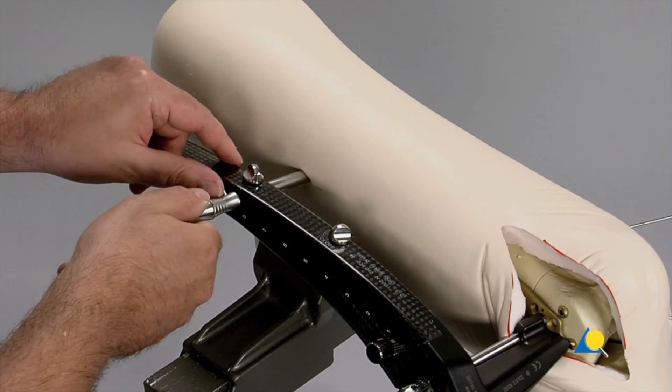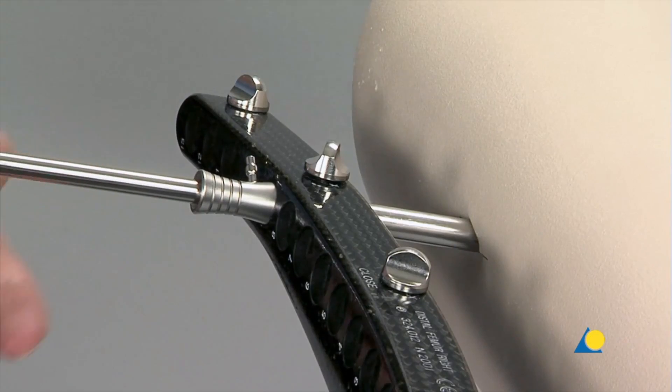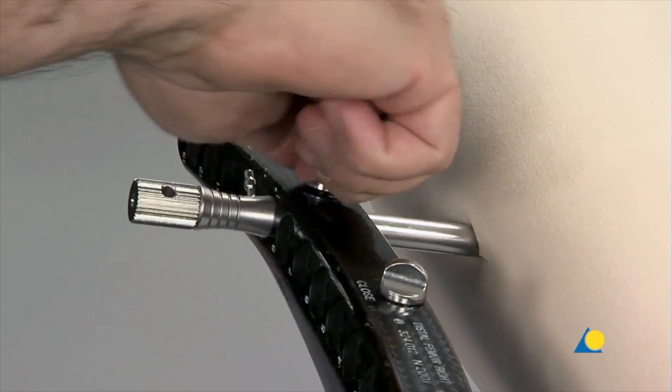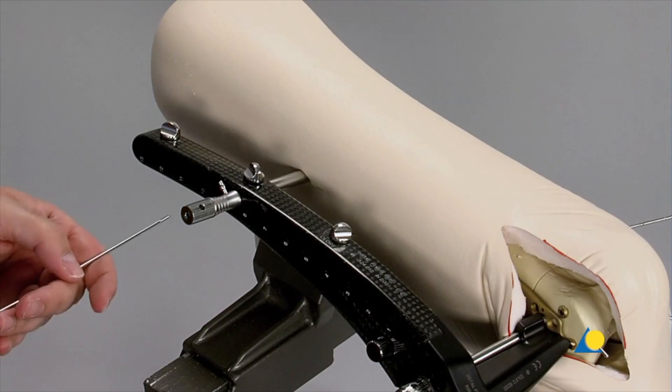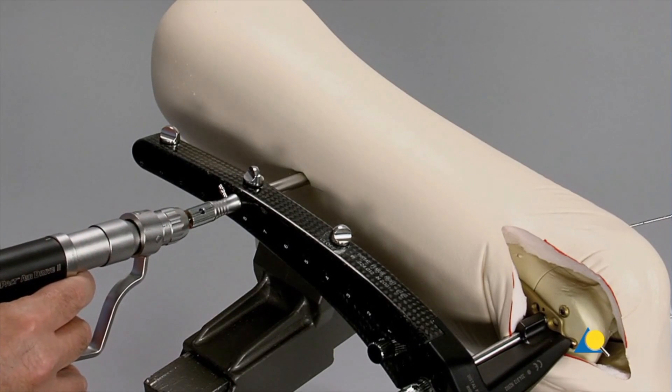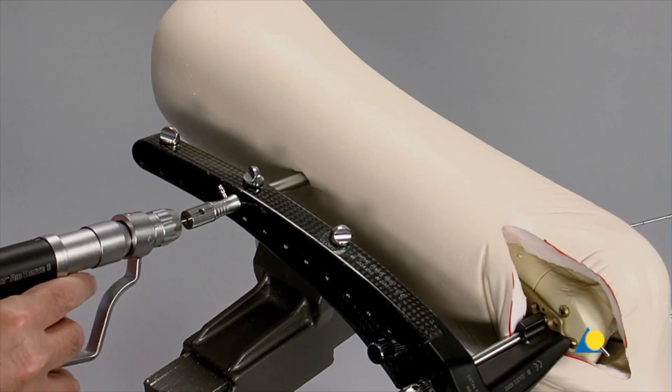The trocar is removed and replaced with a stabilization bolt which is screwed into the plate hole. A 2 mm K-wire is now introduced. At this stage, both the position of the plate and the fracture reduction are checked under image intensification.